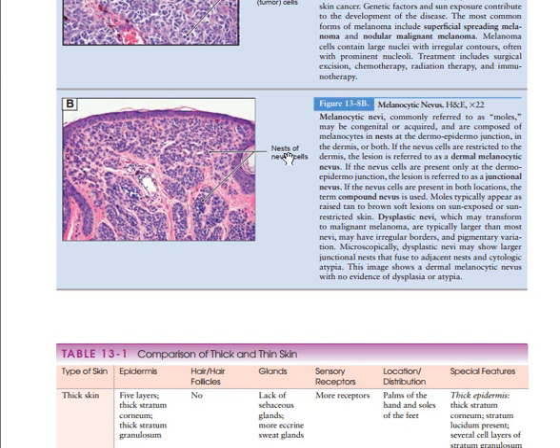Is it clear? So when you have those melanocytic accumulations, on the histology section you have nests of melanocytic cells called nevus. In a particular nest you have melanocytic cells accumulated. If they are accumulating in the dermal layer, it is going to be called dermal melanocytic nevus. If they are accumulating at the junction between the dermis and the epidermis, they are called junctional nevus. If they are both dermal and at the junction, they are called compound nevus.